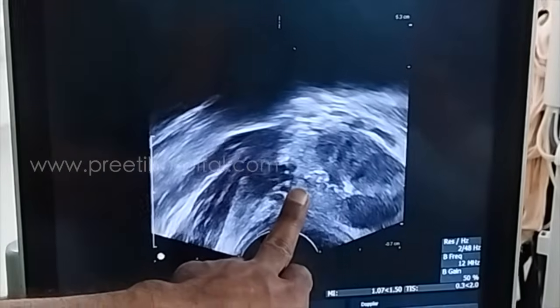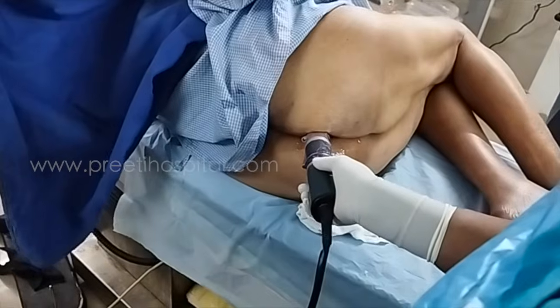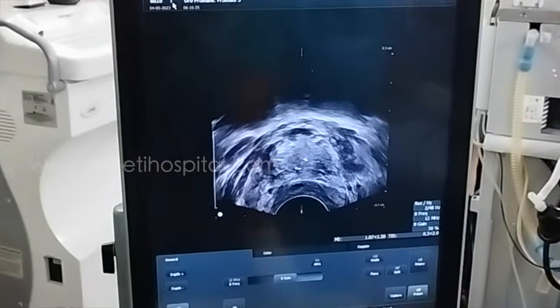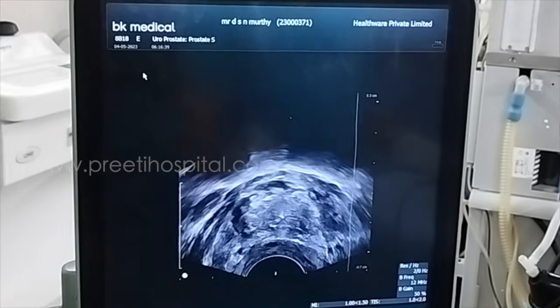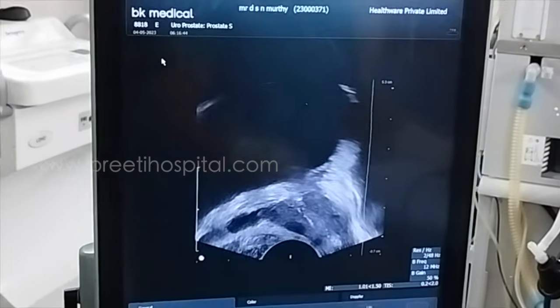But if you are in axial cut, if you show up, what will happen? The left side will change. Even in axial, can you show in axial? Yes, I will. This is transverse. Transverse and axial view are the same. But the movement to see right and left is different. Show me the axial. Now this is end firing.